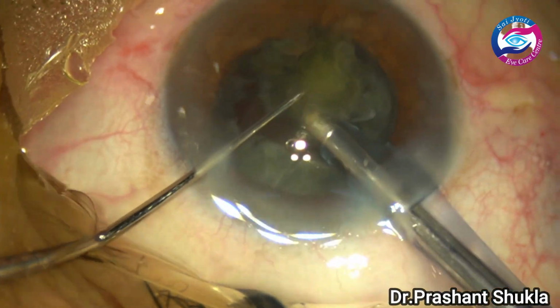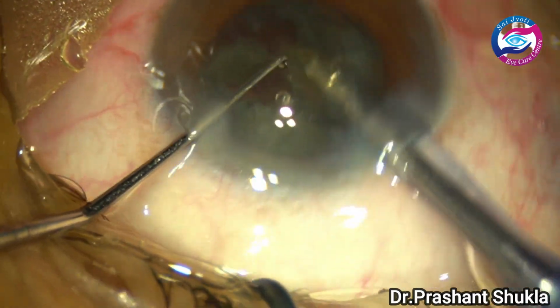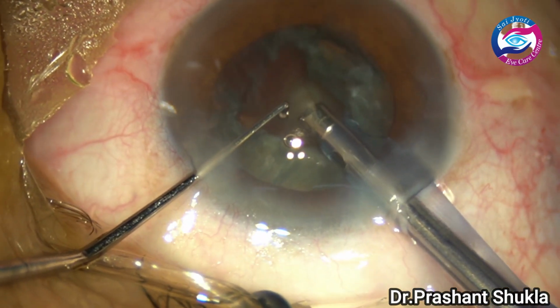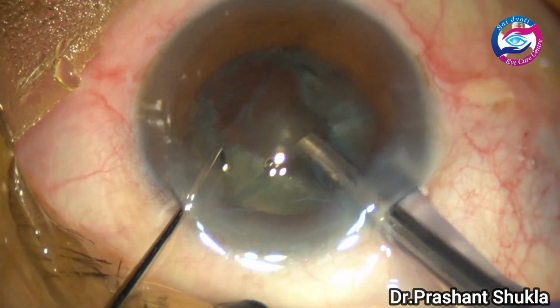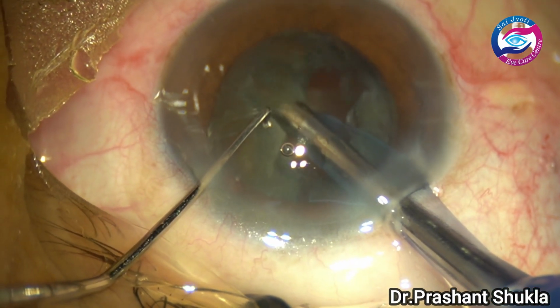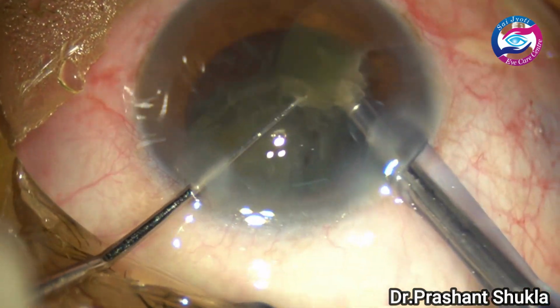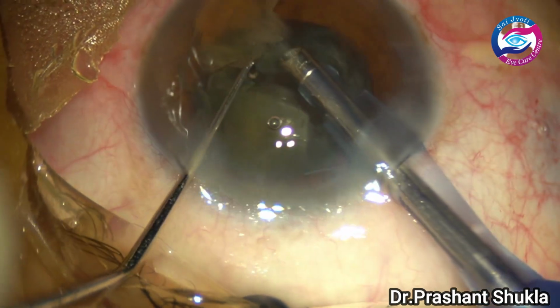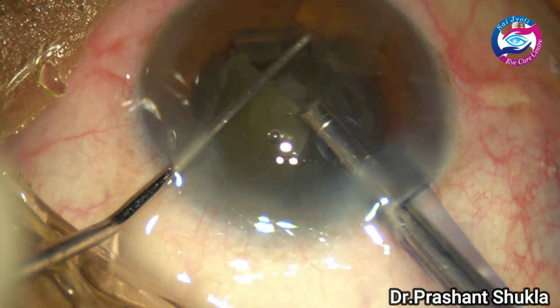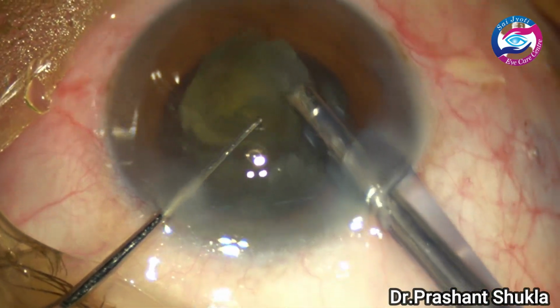Using the other instrument, the sustainer, I am trying to feed that small piece into the phaco handpiece, and here I have removed one small nuclear fragment which was separated probably during pre-chopping. The nucleus is rotated, and the other heminucleus is held using phaco power and vacuum. Here again I am using very low phaco power, about 25, considering the density of the nucleus. The vacuum being used is 250. Slowly the nuclear fragments are emulsified into the phaco handpiece.